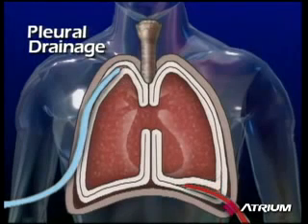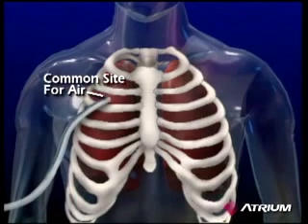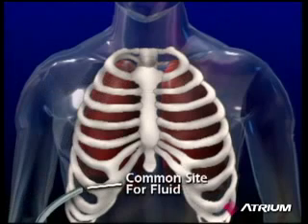The purpose of any chest drainage device is to help reestablish normal vacuum pressures by removing air or fluid in a closed one-way fashion. For pneumothorax, the chest tube is typically placed anteriorly near the lung's apex. For a hemothorax or pleural effusion, the chest tube is placed more laterally in the lower part of the chest to facilitate more efficient fluid drainage. Frequently, 2 catheters are inserted.